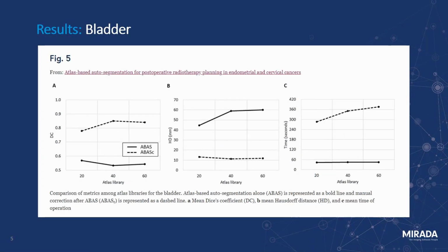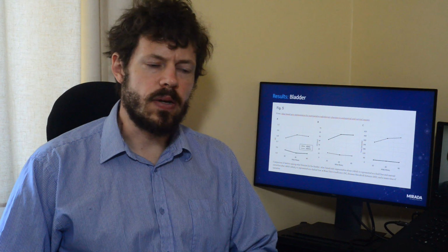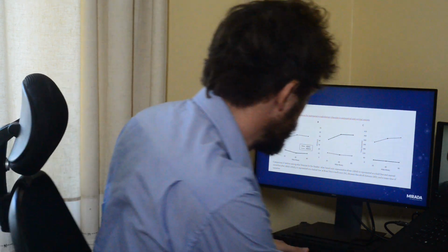For the bladder, the authors found quite poor performance, which wasn't really affected by increasing the size of the database. And again, the time taken for editing the contours seemed to increase as the database size increased. So let's discuss this paper with Nalee now.